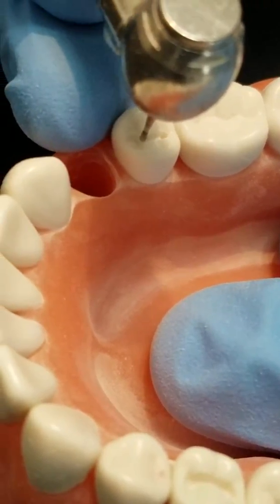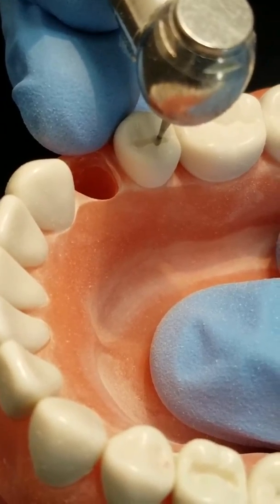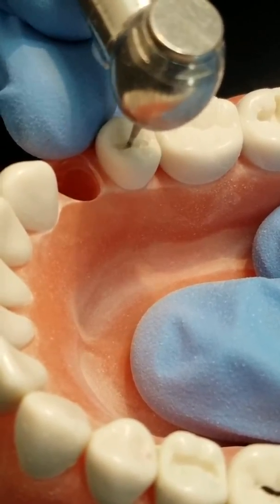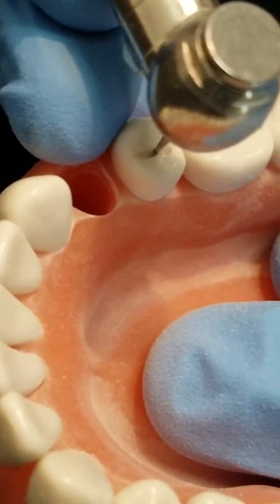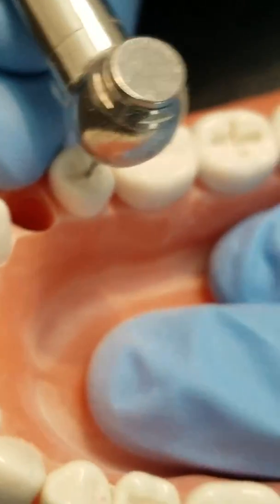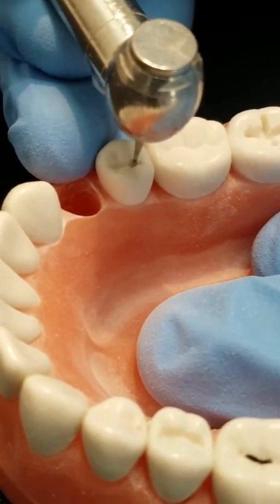You can hear me slow down on the pedal. I want to slow down to about a third of the speed on the high speed as I go back and forth, keeping the same hand movement and the same straight line across. All I'm doing is going deep on the central groove to get that one and a half millimeter minimum with the bur, and I'm looking at the depth of the bur which is exactly one and a half millimeters.